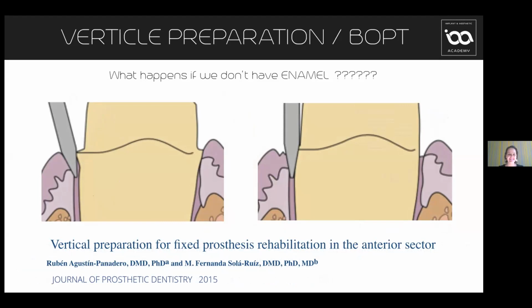So you'll see that as you've gone from the left picture to the right, you've straightened it. Because if you continue going at the angle on the left, you're going to create undercuts. And so this is the only danger. But as I say, once you've done a few, it's a much simpler and much quicker process than a horizontal preparation.